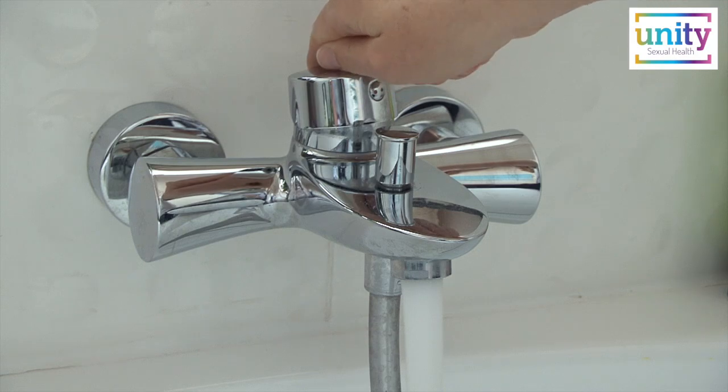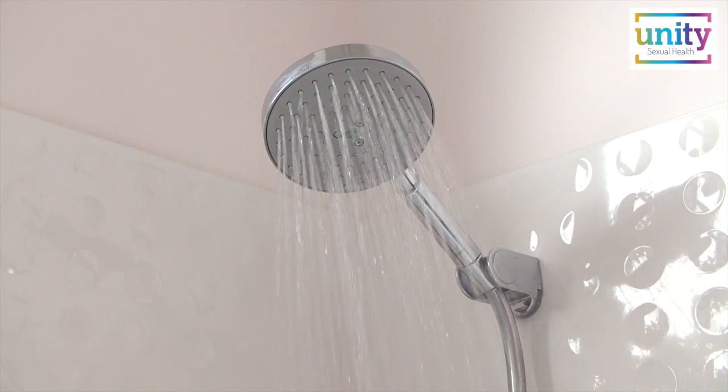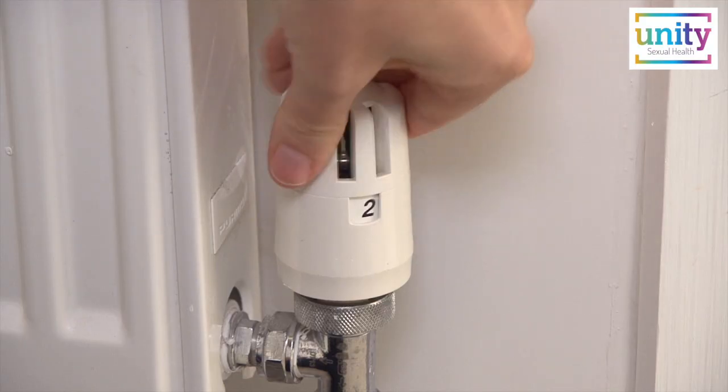First, it is important you are warm. If you are feeling cold you may wish to take a warm bath or a hot shower. If you have heating in your home, turn it on or increase the temperature.